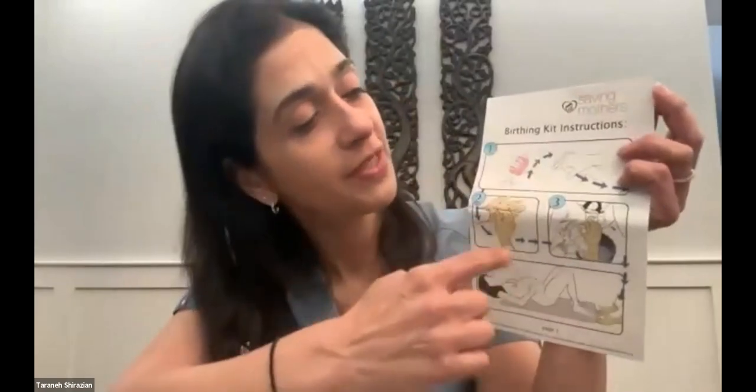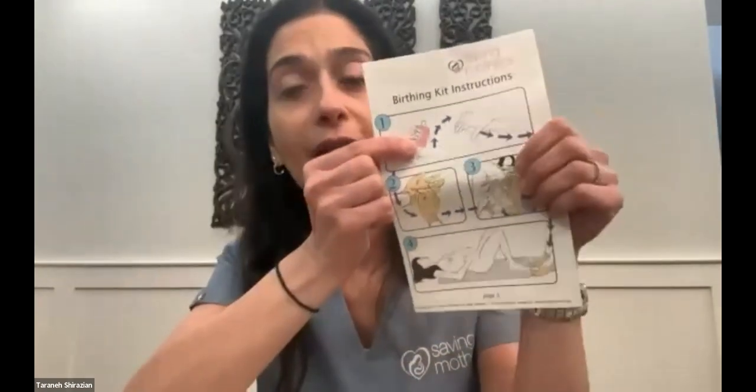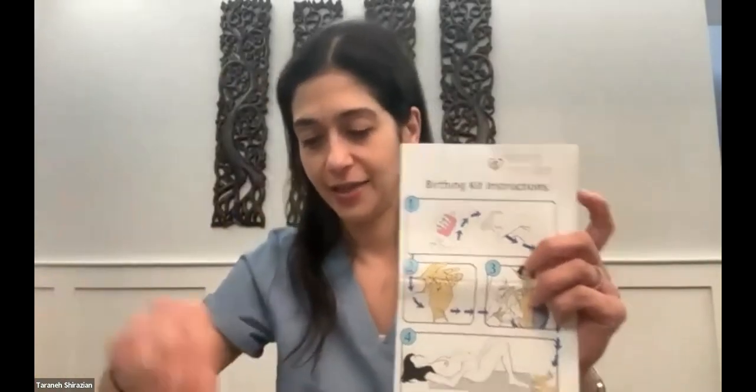So it goes through the steps of a delivery using Purell. So we include Purell in the kit because there's no running water in most of the world. I think people may not realize that, or the water may not be sanitary, right? So this is Purell to help clean the hands.